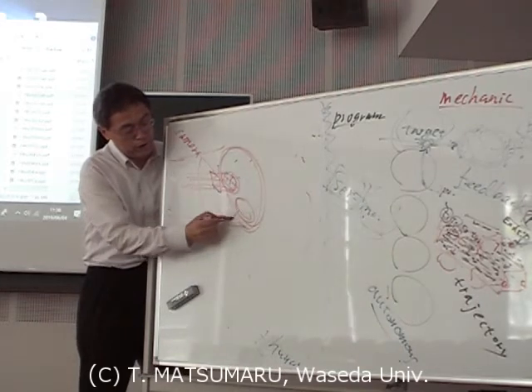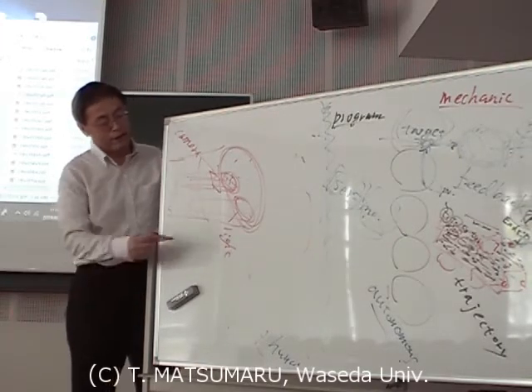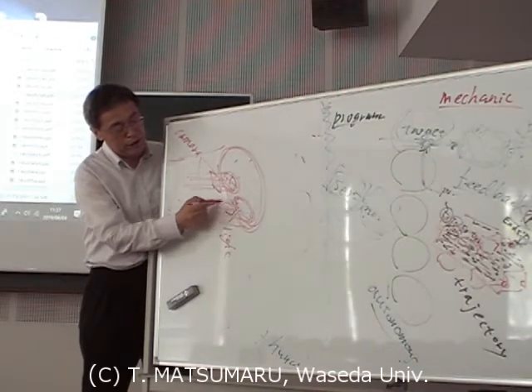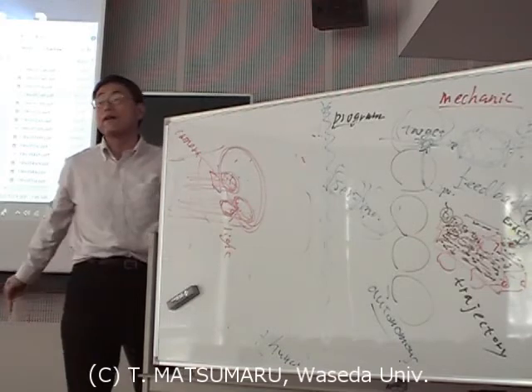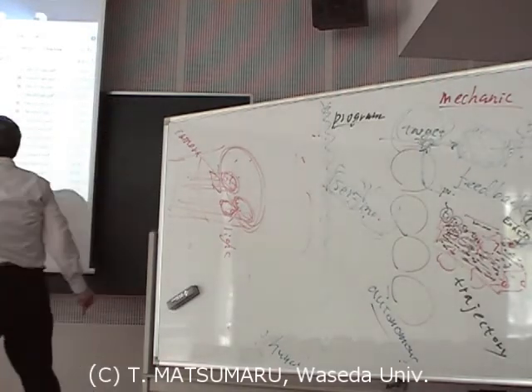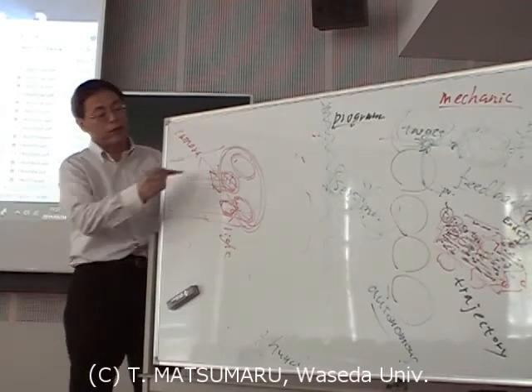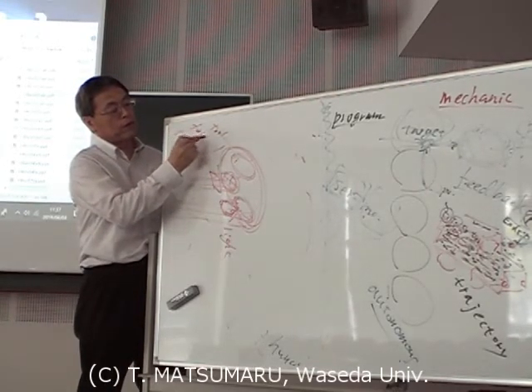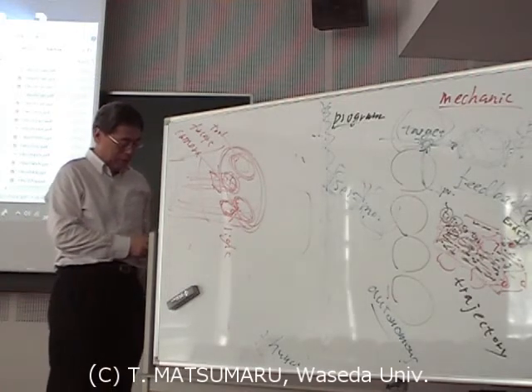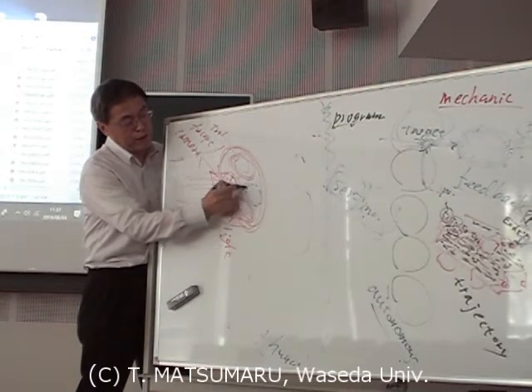Light. Oh, light. Light is necessary to watch inside because it's a dark part. At first this was also a fiber light, but presently some electric light device is there. Then there is the one I just mentioned, the forceps, for tools like cutting tools. What else is necessary? At least another one is necessary.